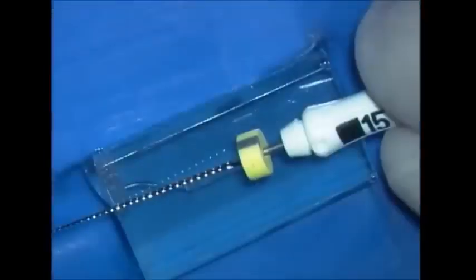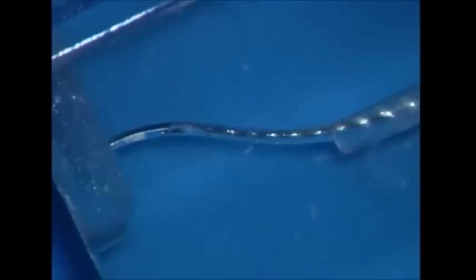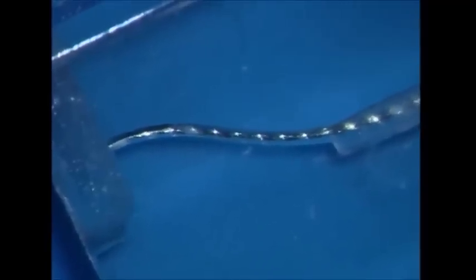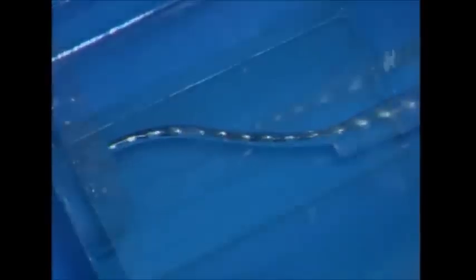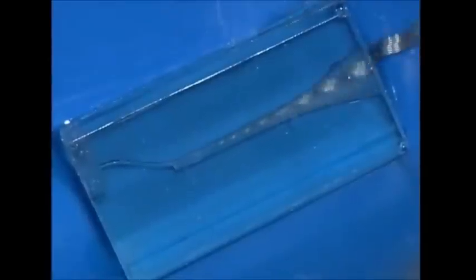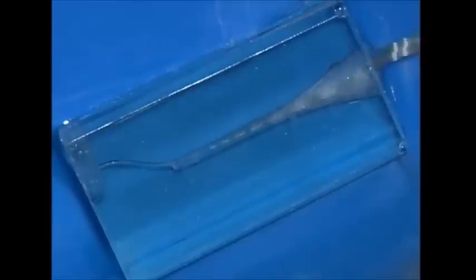The next sequential instrument is the 15 file. The instrument is pre-curved as usual, the handle reciprocated to walk the pre-curved instrument past the ledge. The instrument is worked continuously in an apical direction until we achieve length. Rotary instruments are used to pre-flare and further expand a shaping wave in the coronal 2/3 of the canal.